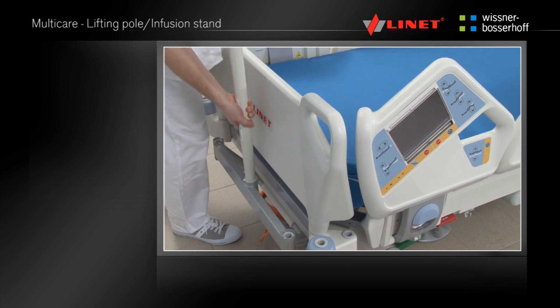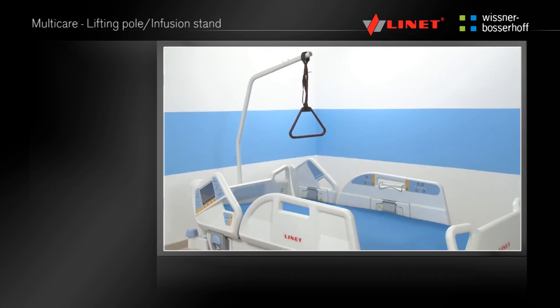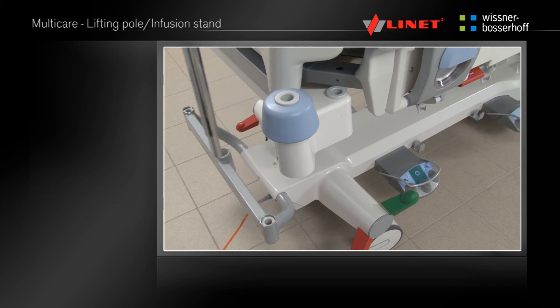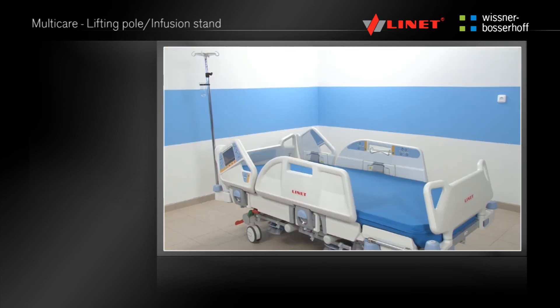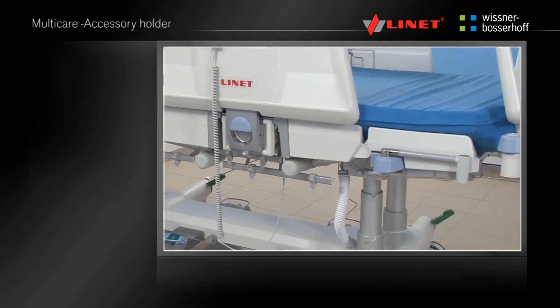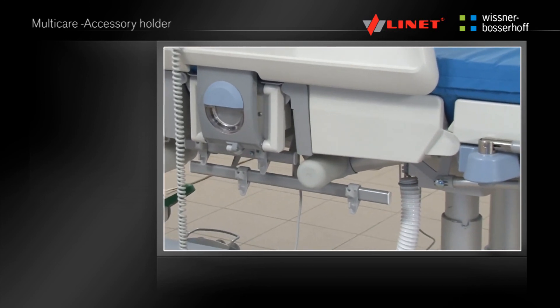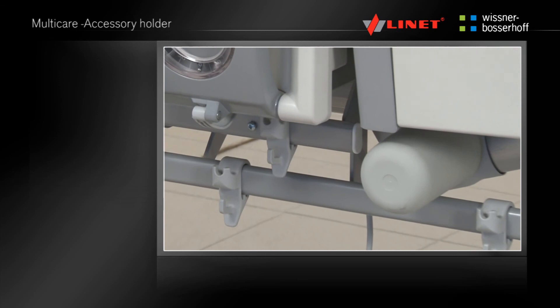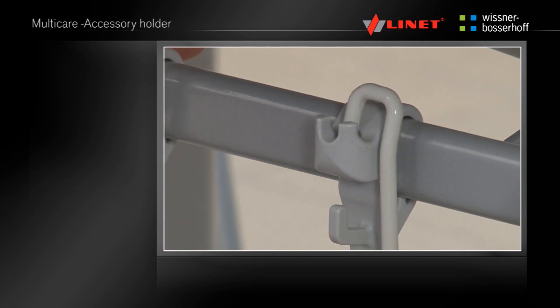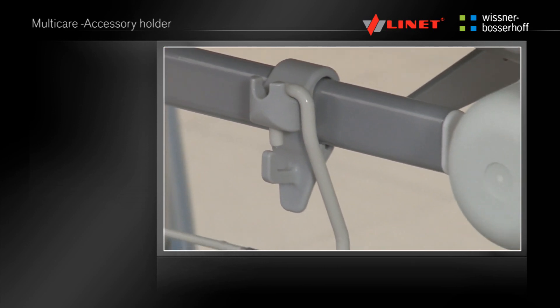A lifting pole and infusion stands can be installed into the ports located near the head end or foot end of the bed. Attachments weighing up to 2kg can be hung from the removable plastic hooks on the accessory rails located under the mattress platform on both sides of the bed. The weight limit of the accessory holder is 10kg.